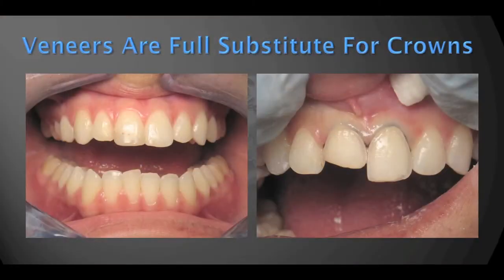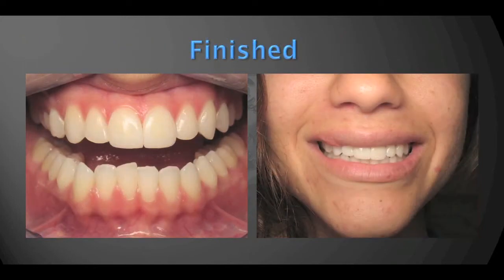Porcelain veneers allow us to have a different approach. The patient has a severe fracture on one central, but we are able to repair what's missing without having to further destroy the tooth. We did the other tooth so we can get a perfect two-central match, and the results are beautiful and healthy — everything is above the gum using supragingival, minimally invasive preparations.